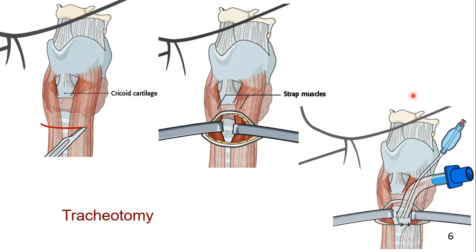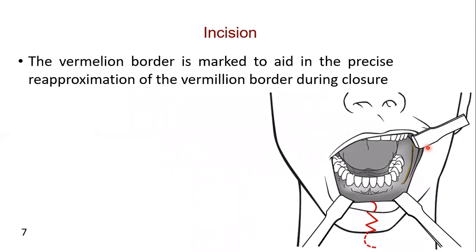Alternatively, a prolonged nasoendotracheal intubation may be performed to avoid a tracheostomy. The vermilion border is marked using the back of a 15 blade and surgical marking ink to aid in the precise re-approximation of the vermilion border during closure.